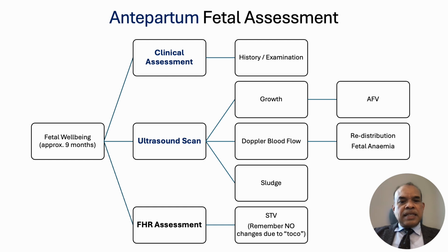Then we have fetal assessment, and antenatally, please remember, we cannot use standard CTG guidelines, which classify CTGs into normal, suspicious, pathological, because they are made for intrapartum assessment. Antenatally, there are no repetitive strong contractions to squeeze the cord, and therefore you will not find big decelerations. And this is why antenatally it is often a cardiograph and not a cardiotocograph. And computerized CTGs may help with short-term variability or STV.